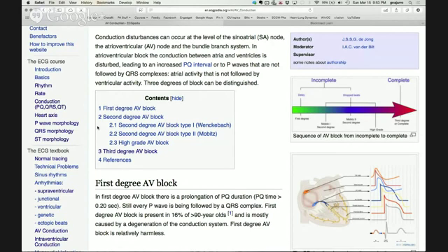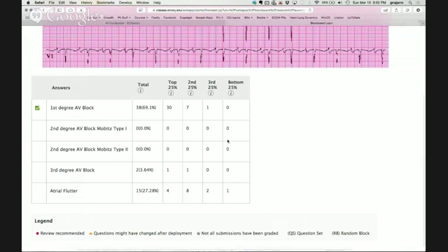James, remember specific. Yeah. Still can see all the answer feedback response about half. Okay, well, let's keep going over some more questions.